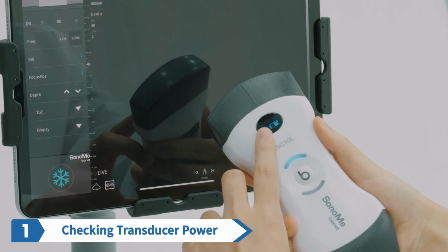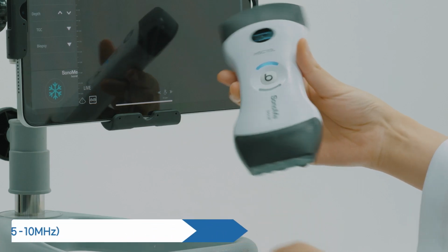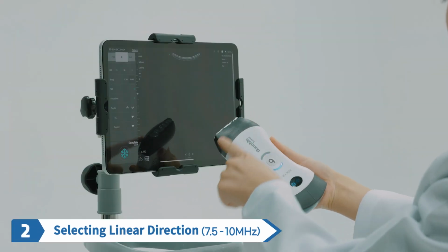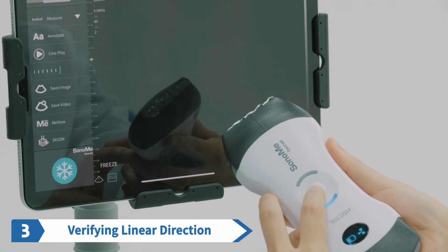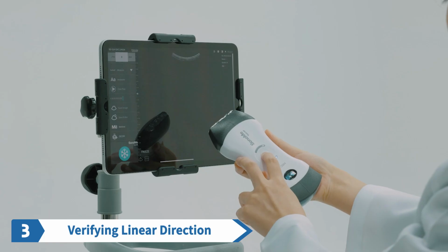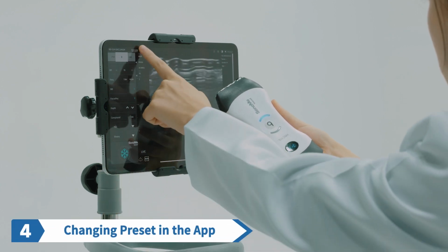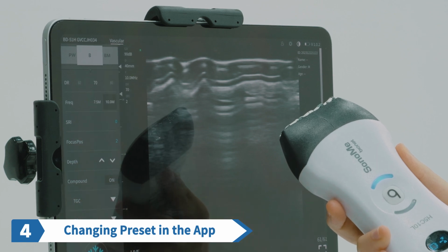1. Confirm that the transducer is powered on and connected to the smart device. 2. Utilize the linear-type transducer for optimal vascular visualization. 3. Activate the linear side by pressing and holding the power button, ensuring that the light indicates activation. 4. In the SonoMe app, go to the preset section, select Vascular, and choose B mode.